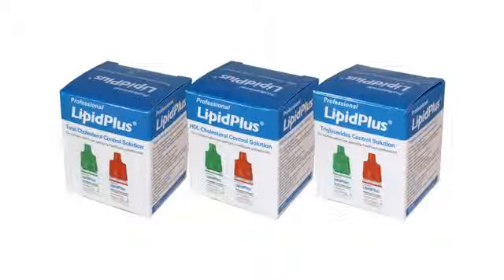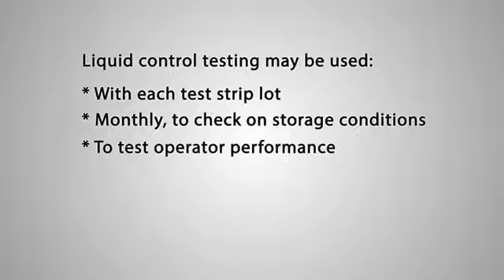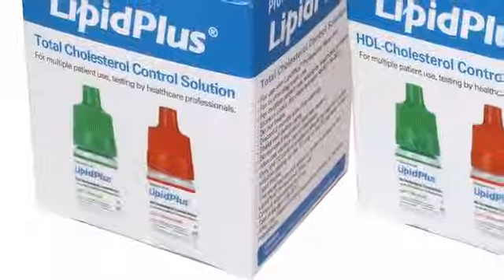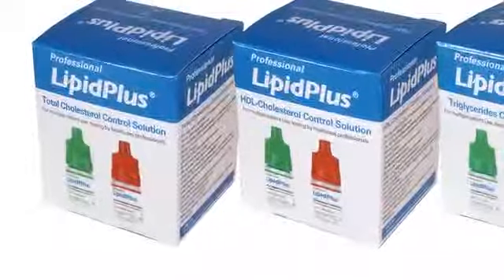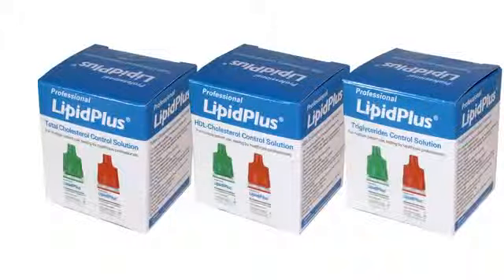Testing with external liquid controls. The healthcare professional should follow their facility's policies regarding quality control testing with external liquid controls. For example, control testing may be used with each new test strip lot, monthly as a continued check on storage conditions, to test operator performance, or if there are questions regarding test results. Level 1, normal, and Level 2, abnormal, controls are available for total cholesterol, HDL cholesterol, and triglycerides. Control solutions may be stored at room temperature and are good for 2 months after first opening the bottle.